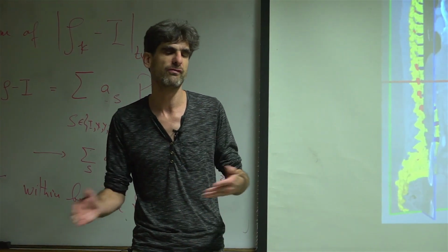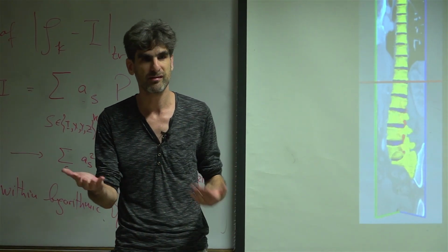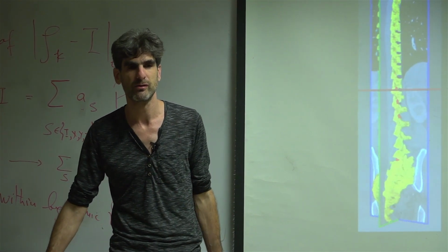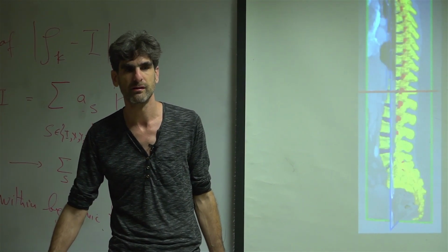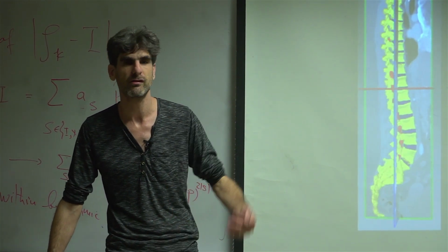In some cases, if you have very little data, you want to do a data-hungry task, and the images somehow recall natural images, then sometimes we do use pre-training. But that's another advantage of segmentation tasks. It's easier to get a good result with less data.